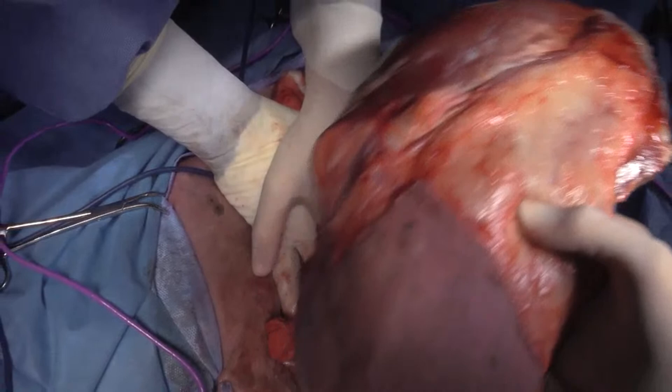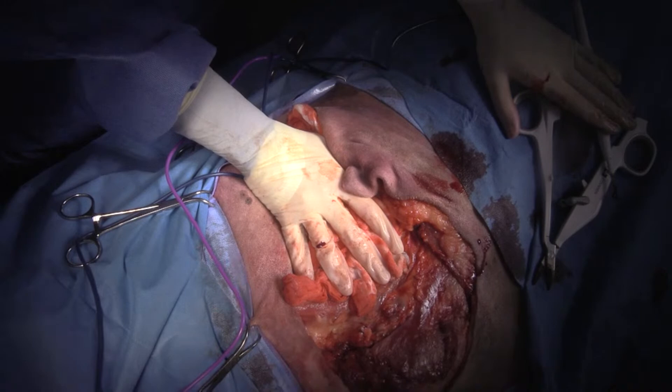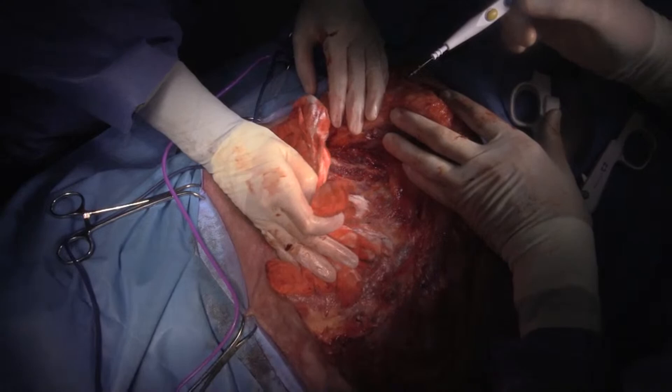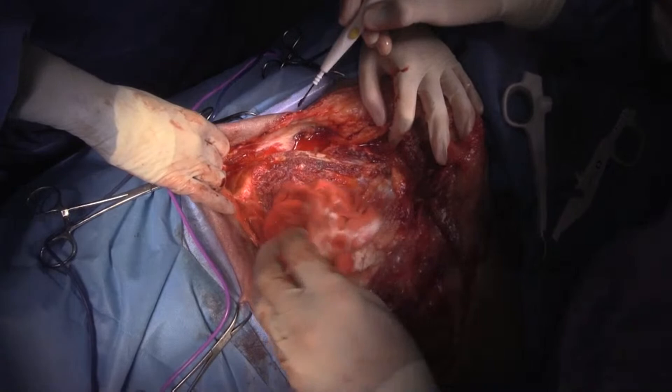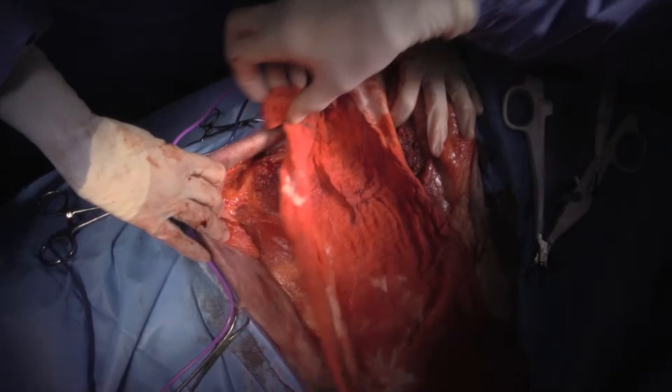I'll just put this on the back table here. We've got still a little bit of bleeding here. And I do get away with just one lap sponge, but I am pushing the friendship a little bit. So that's the whole amputation there.